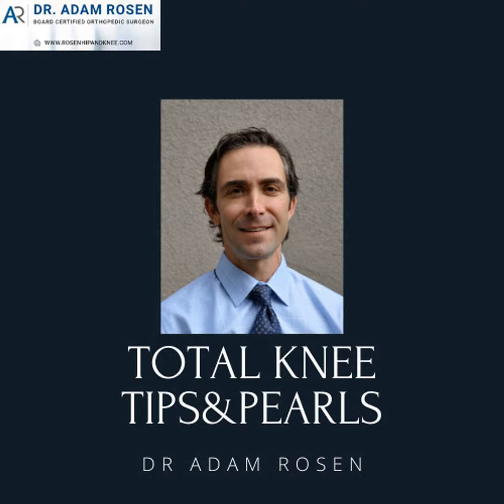Now, if you're looking at a hip, same thing. You might say, I have a weight-bearing AP of the pelvis. You might say it's more of an inlet view or an outlet view. Again, that cues you into some other issue. Was that the view, or is that some pelvic change due to some lumbosacral issue? And then I might have an AP and lateral of the hip. Is the lateral a frog leg? Is the lateral a cross table? I'm being very specific, but it's letting you know.